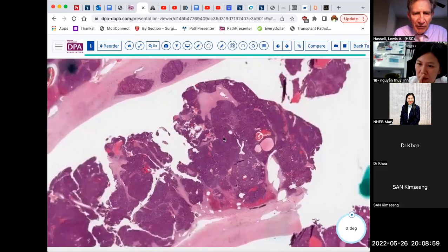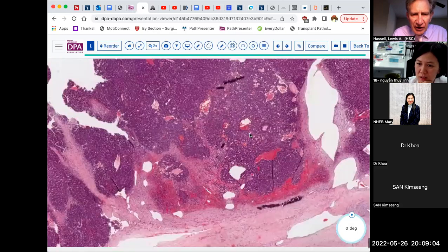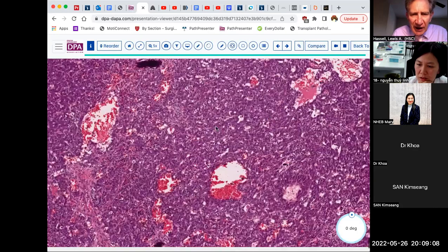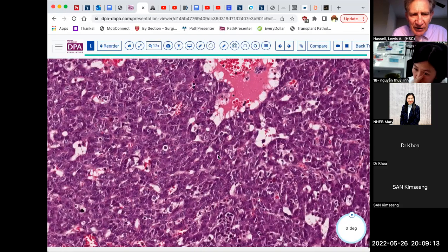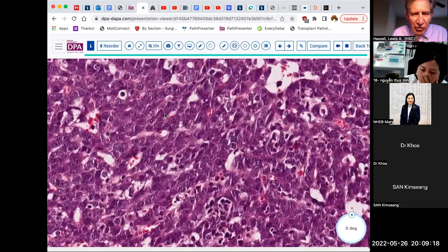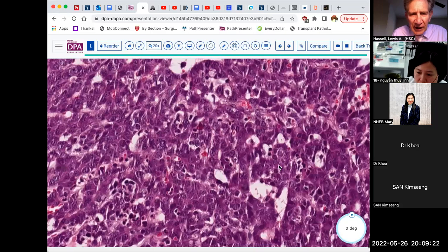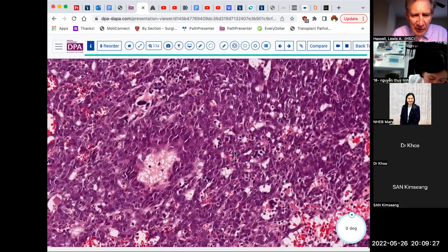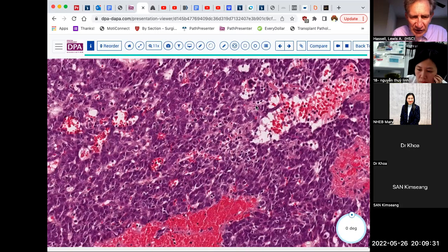Here's another example, very blue example. You can see a sharp margin here. And this is sort of an almost angiomatous type of pattern with a very immature blastomatous type of tissue, very immature, scant cytoplasm, a lot of open vacuolar type spaces or pseudoglandular spaces, and interstitial hemorrhage and so forth that you can see here.